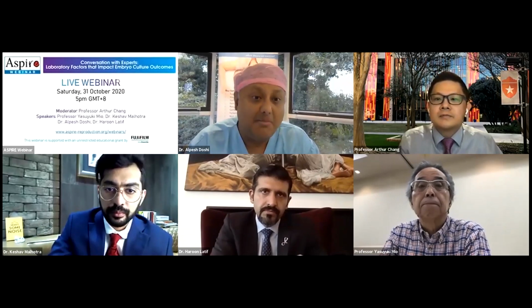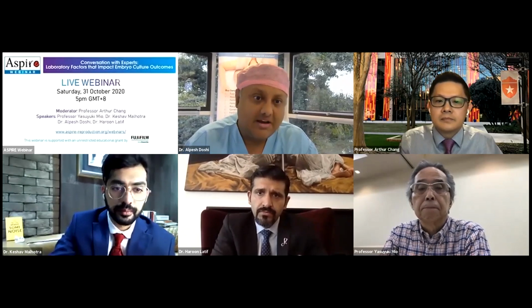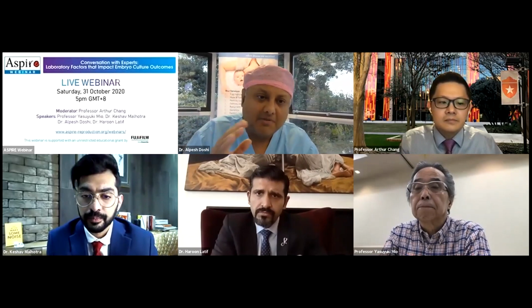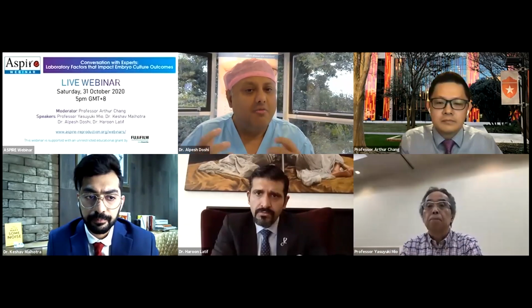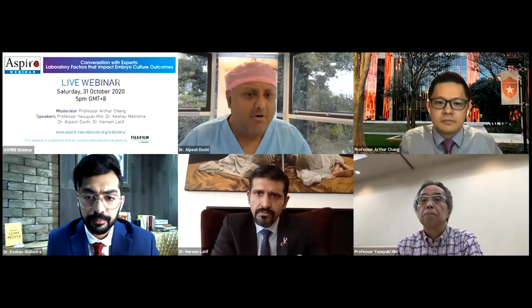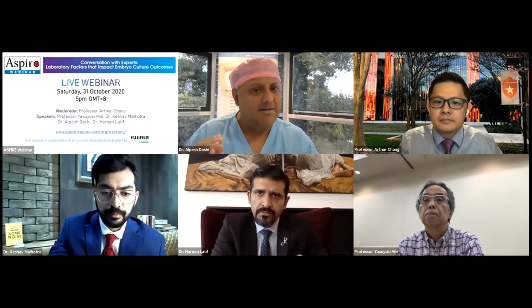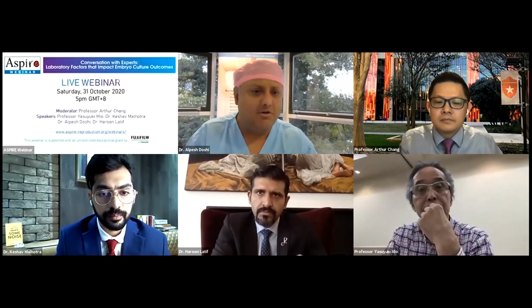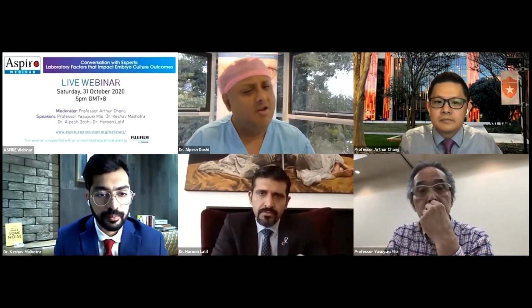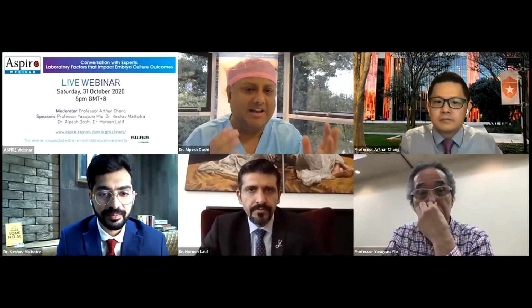Typically on day 3, I make the opening around 10 to 15 microns of diameter. This allows a good streamlined layer of trophectoderm herniating out without risking the whole embryo coming out when you're pulling the cells. So I like making the channel a bit narrow and still big enough for the cells to herniate out and not risk the whole embryo coming out, which would then pose a further risk during cryopreservation, stickiness, etc.